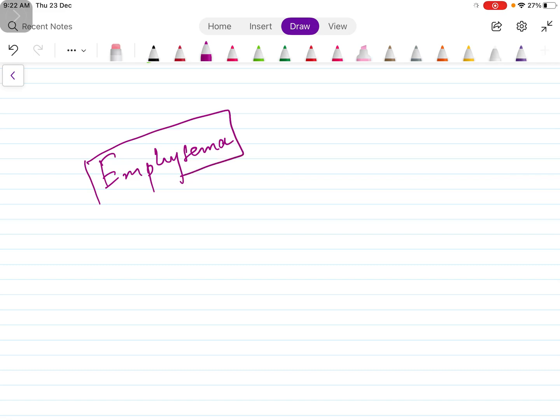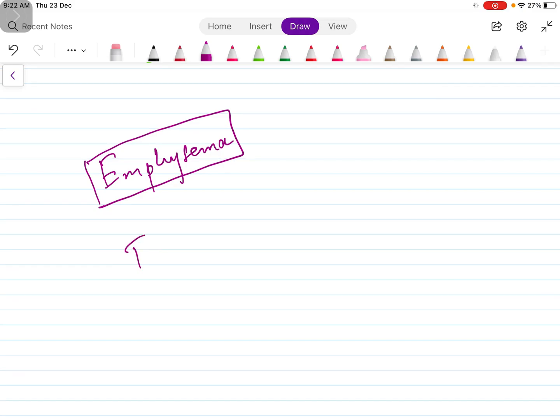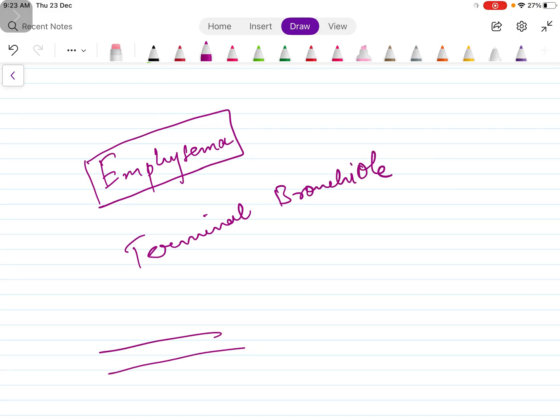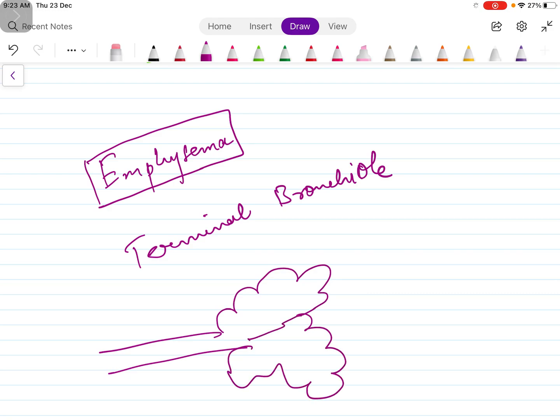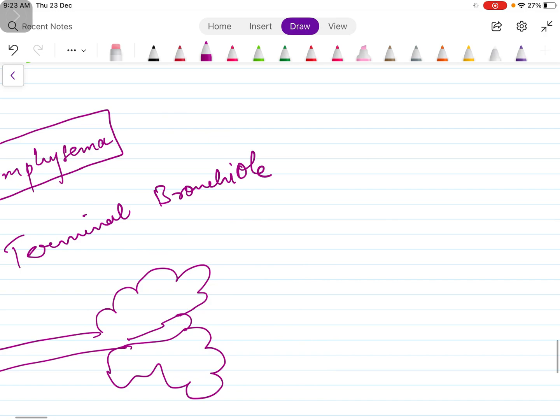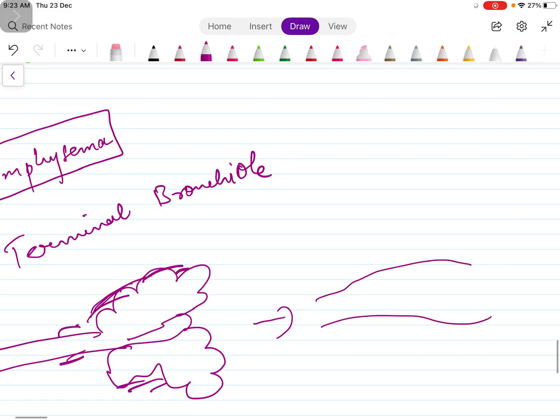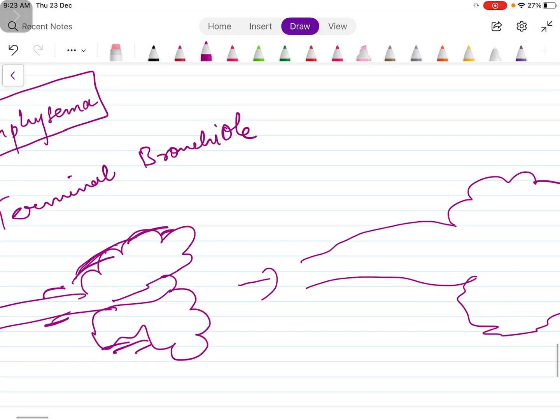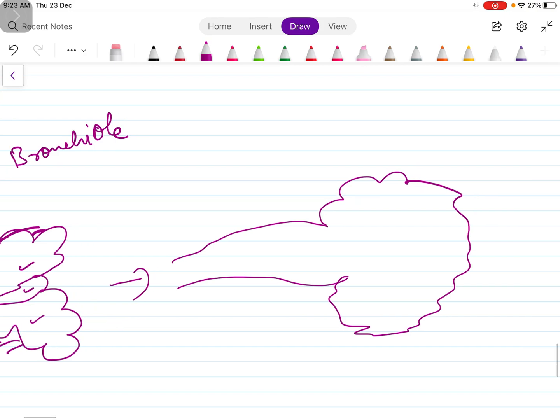In emphysema, there's a permanent dilatation of the distal airways, distal to the terminal bronchioles. These are the airways and these are the alveoli. This is the normal alveoli.